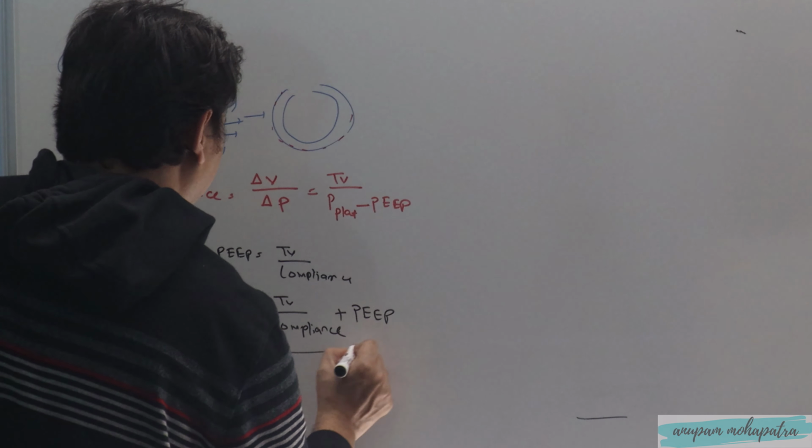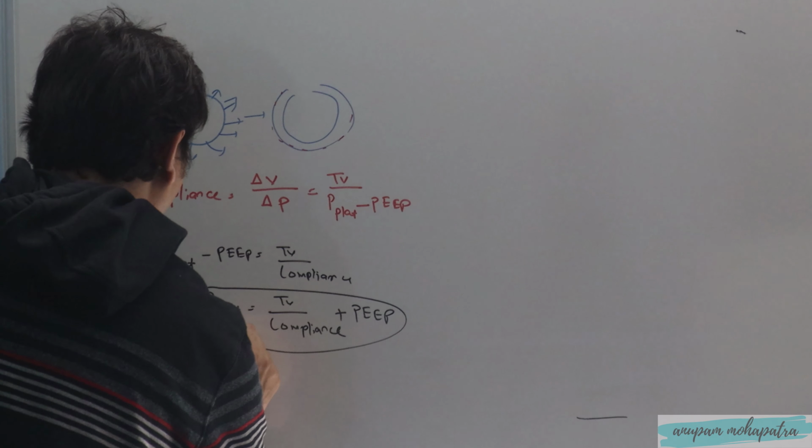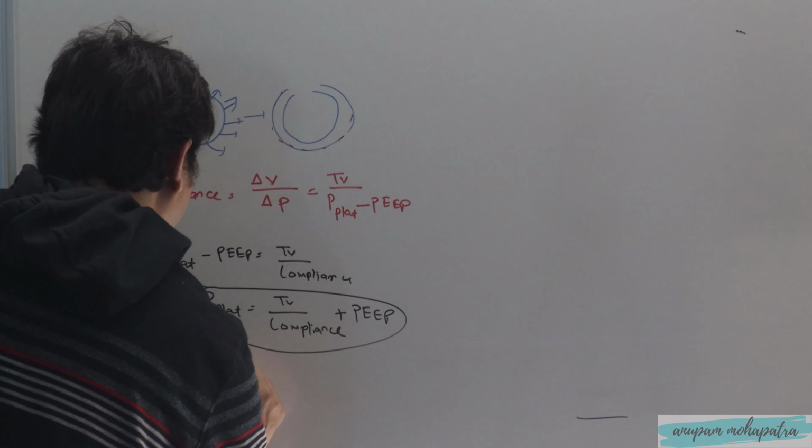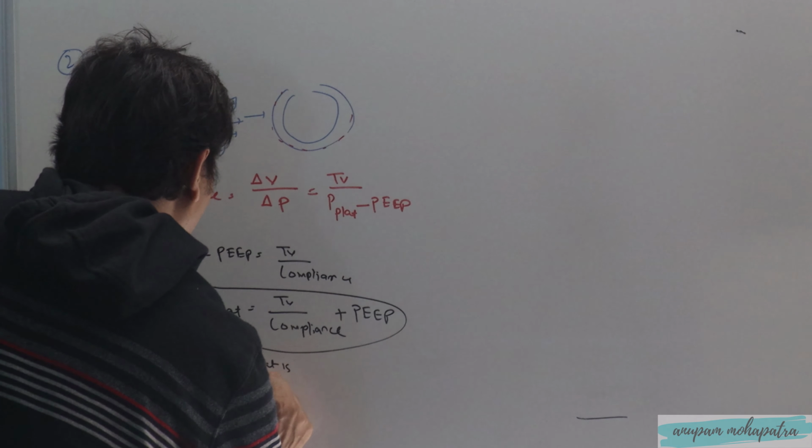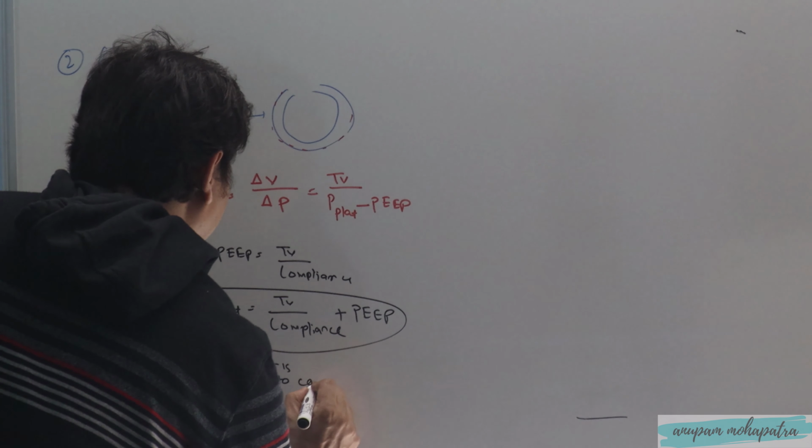This is another formula, the pressure that is due to the compliance of the lung.